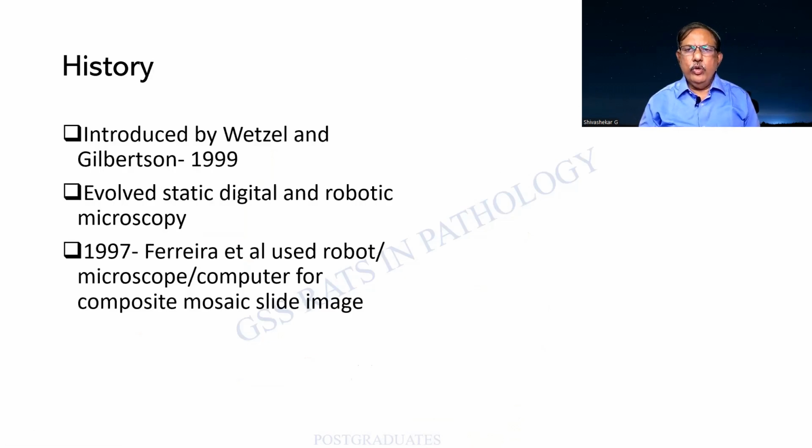The history of it goes like this. It was introduced by Wetzel and Gilbertson in 1999, and they evolved the process of digital, static, and robotic microscopy. And it was in 1997 that Ferreira used the robotic method for the microscopes, operating the computers, and also handling the slides.